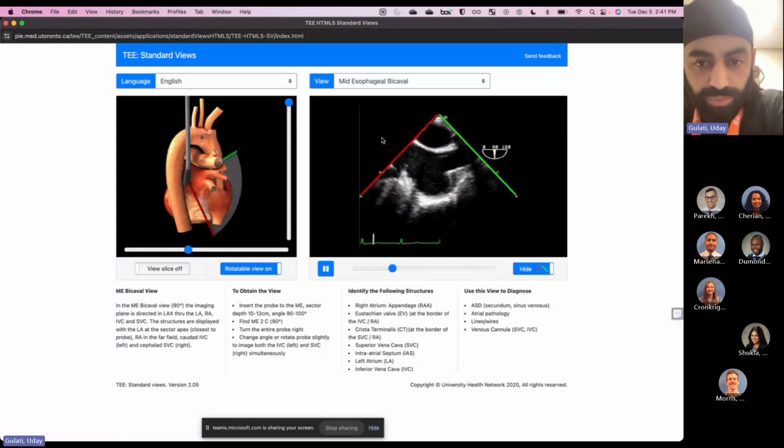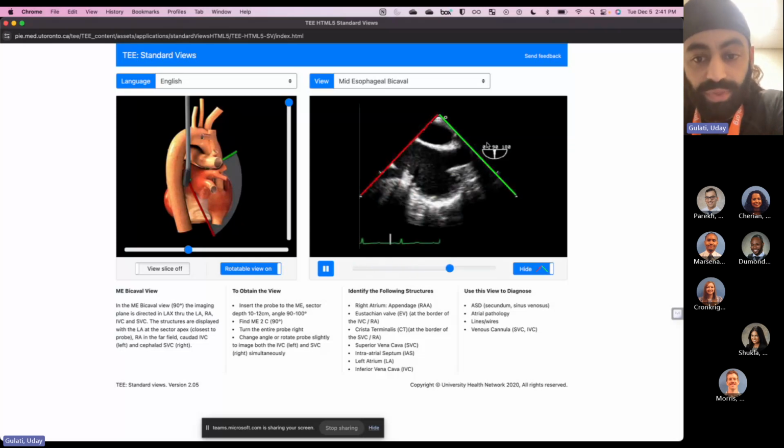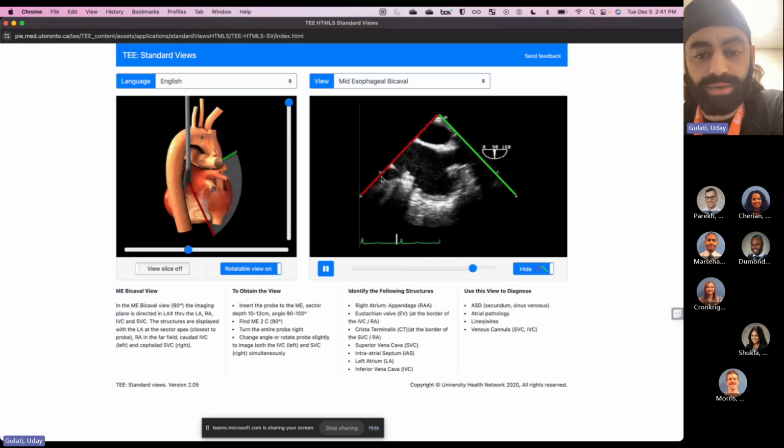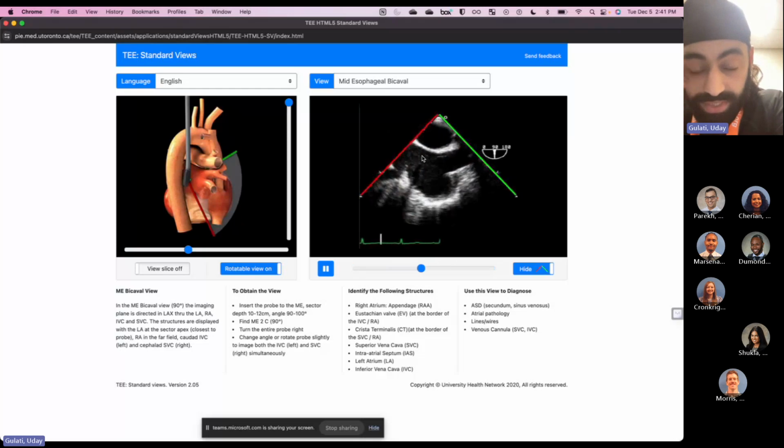And we talk about those dual lumen cannulas, like Avalon cannulas. Those are even harder, because you want to see your wire go all the way down this way into your IVC, and then one of the holes is here. The other one, where the drainage cannula is, is here. The return cannula has to be directly facing your ventricle to shoot out blood this way, which is one of the downsides of those dual lumen cannulas. Any questions about those 4 views?